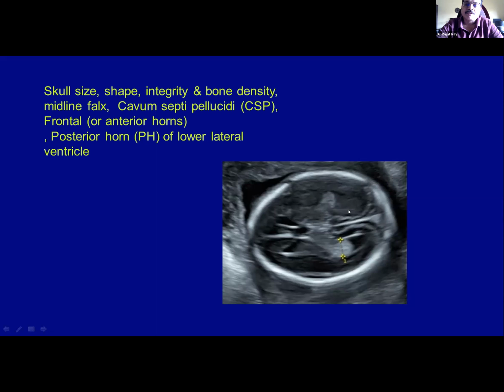And if it is echogenic, what will happen? First, the near half of the skull, the near half of the brain will have a reverberation artifact. So the far away half will be more clear in comparison to the nearer half. If it is not ossified properly, both the halves will look similar. And you can compress the head also with your probe.